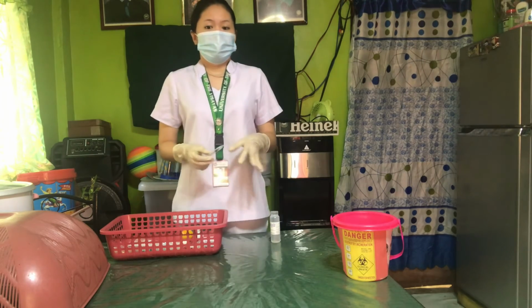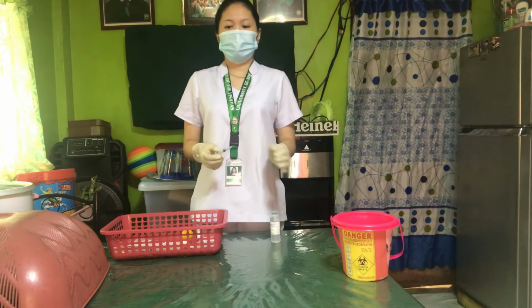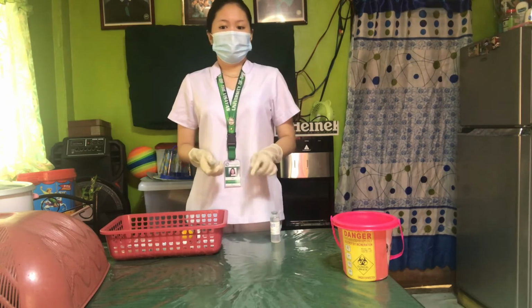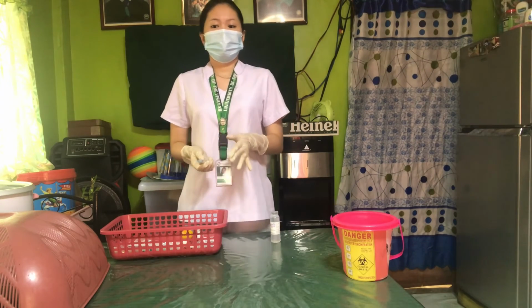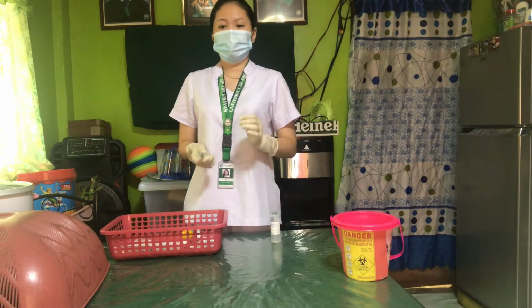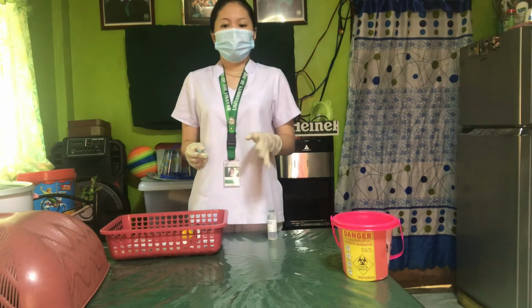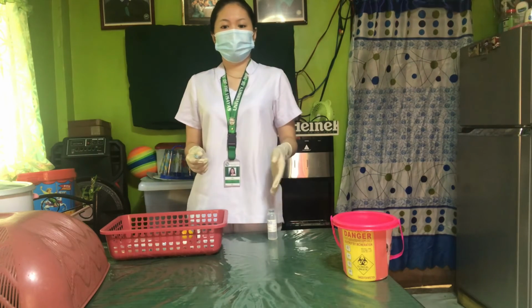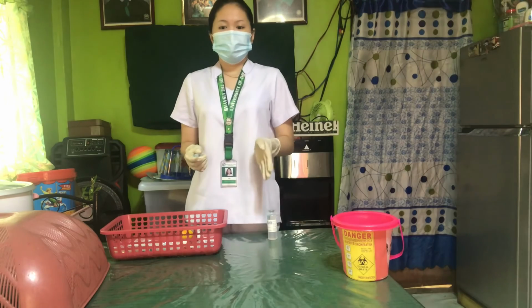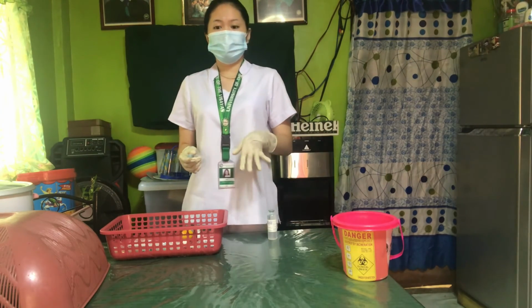Next is carefully insert the needle into the upright vial through the center of the rubber cap, maintaining the sterility of the needle. Air bubbling through the solution could result in withdrawal of an inaccurate amount of medication. Next is inject the air into the vial, keeping the bevel of the needle above the surface of the medication. The air injected into the vial will allow medicine to be drawn more easily.